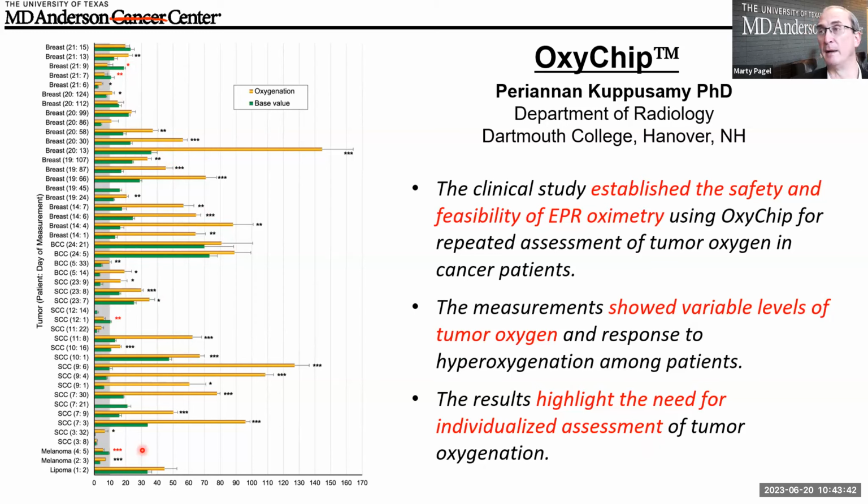they're inconsistent among the group, right? And in fact, that is not a detriment. I think it's really important for us as molecular imaging researchers to consider that we have to really evaluate individual mice and not just the whole group and take the average and be happy with our publications. Because frankly, patients don't care about the group average.